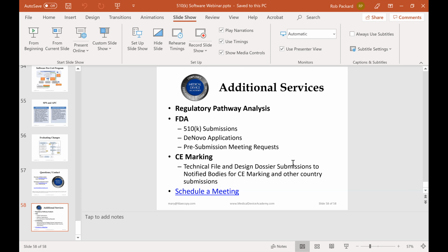But do it in a way that says, these 40 bugs are things that are cosmetic only or have no impact, and here's the reason why we're accepting release of the product with these bugs. These other ones are more significant, but we're also releasing it with the product. These bugs here, we're not releasing our product with it until they're resolved.